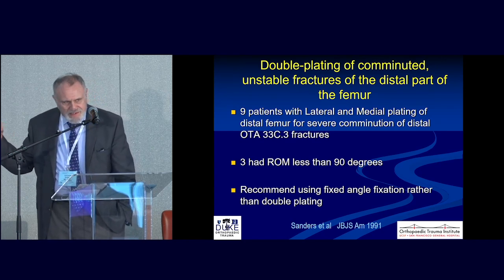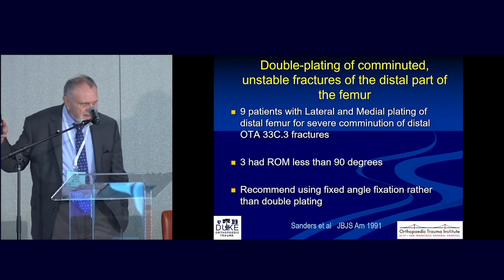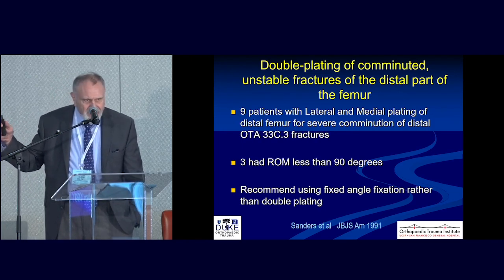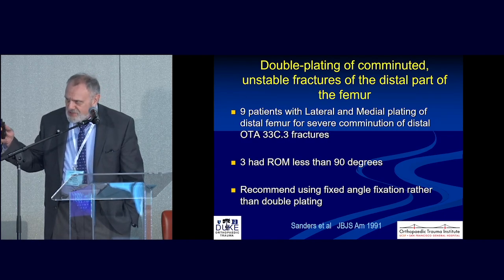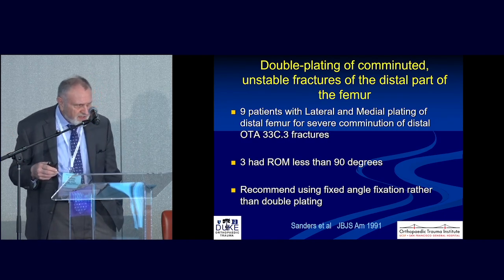And I put this up here because, of course, double plating is becoming a thing again. But the reality is the problem then and the problem now is that you can get stability with double plating, but the joint gets stiff. And that's still a problem today.